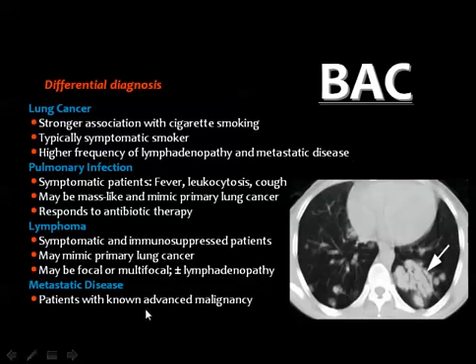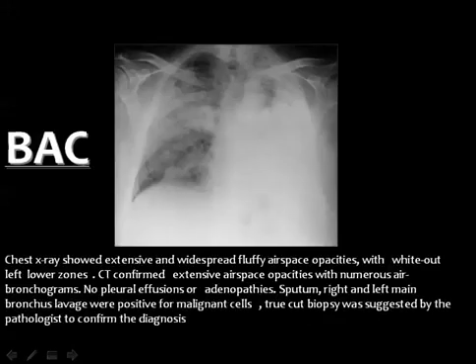not seen here. With pulmonary infection, you got fever, you got leukocytosis, you got cough, and the opacity is just a consolidation with air bronchogram, and it responds quickly to antibiotics. Lymphoma is one of the underlying causes that can produce a similar appearance. And with metastatic disease, usually you may know that the patient had a primary malignancy.